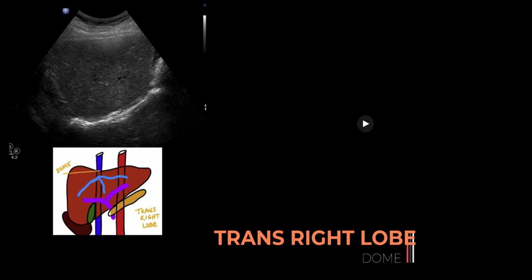Again, we are going to start at the superior portion of the liver and work our way inferior. To begin this picture, we are going to start on the anterior portion of the abdomen in the subcostal portion, and we are going to angle towards the patient's right shoulder. It is helpful to have the patient take a large breath in, pushing the dome of the liver towards our transducer.